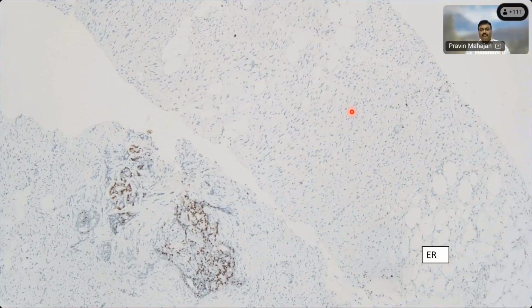So you also have to do the breast biomarkers, right? So breast biomarkers, what we do is ER, PR, HER2. These are called predictive markers. You know why we call it predictive, Shefali? We say predictive markers. So what are we predicting here? Can anybody say from the audience also, or Shefali, you first tried to give the answer. But if you don't know, somebody else can tell.